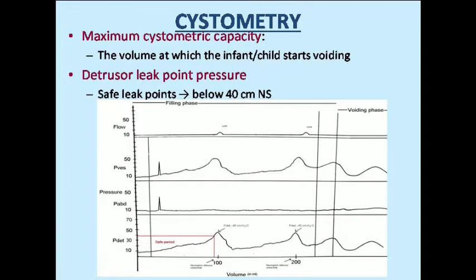So if the volume specific relationship with pressure is changing frequently, that itself is dangerous, even if the infilling pressure is only 30 centimeters of water. So that is what must be remembered. So do not go by values. They are not important. It's a clinical decision, and the patient's other parameters which are far more relevant in interpreting urodynamics than isolated values given to you at the end of the study.